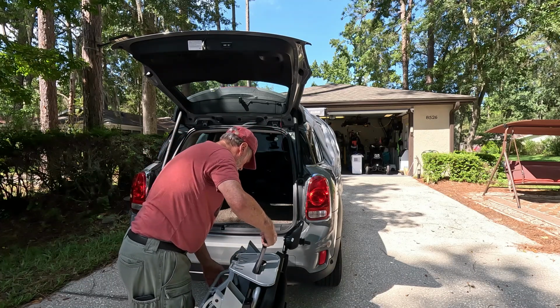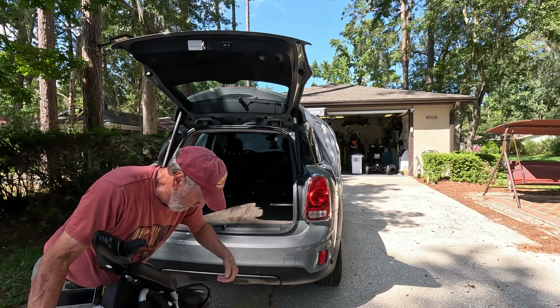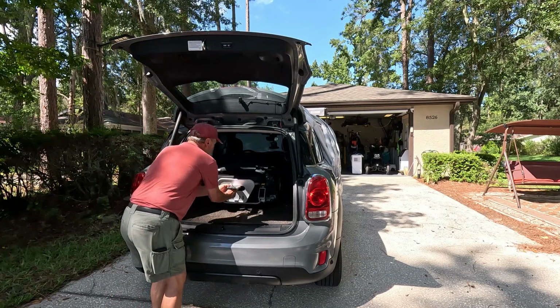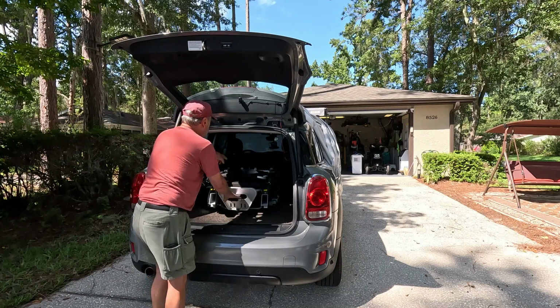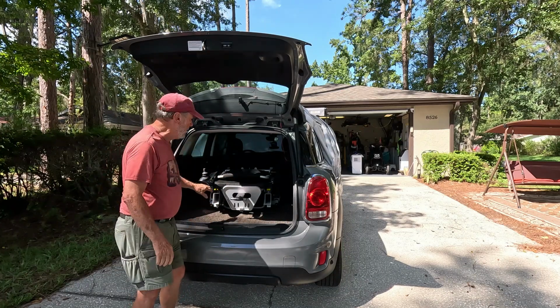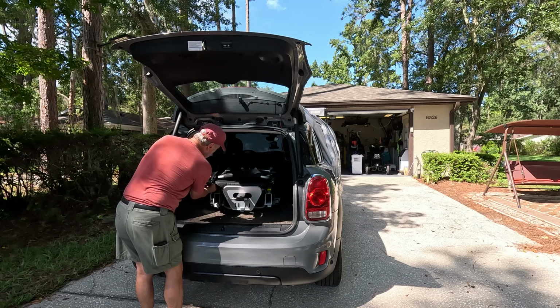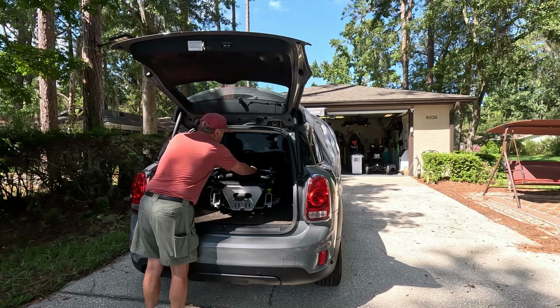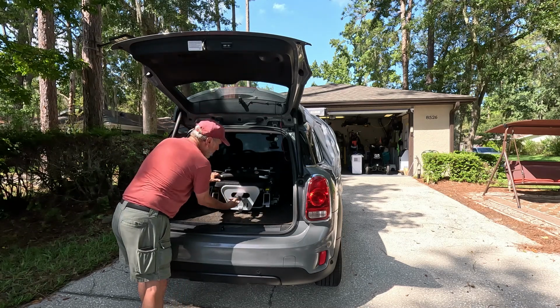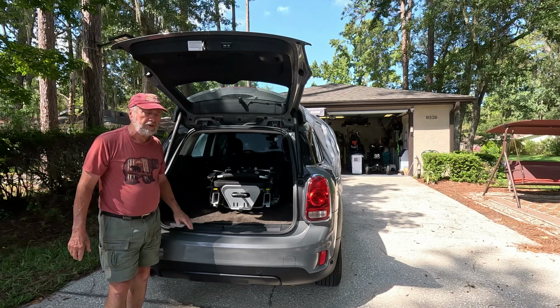And I'm going to see if I can pick this up. So I just pick it up like this. And then just roll it in. And there. And then what I can do is throw it into drive, and the wheels will lock and keep it from rolling. So that's one of the things that I could do. And this could be taken off so that it doesn't stick out, and put right in here. There we go. And then this can go back in there like that. And I'm ready to go to the shopping mall, the grocery store, wherever.